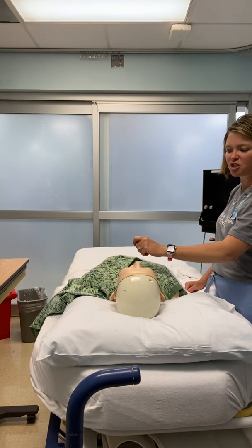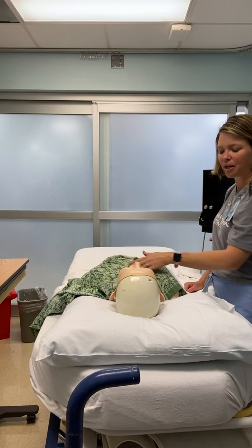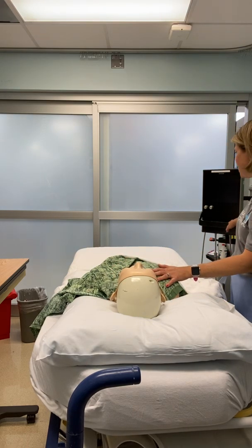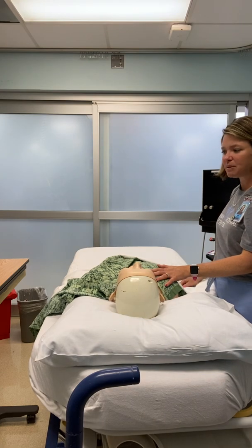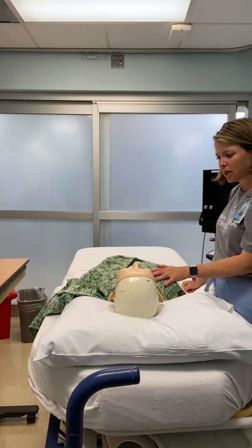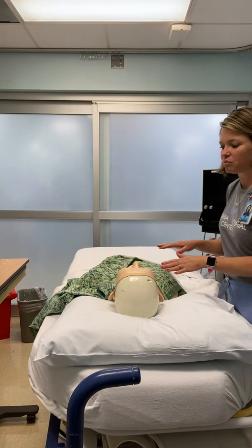So after the procedure, the patient is cleaned up, drape removed, those sorts of things. A lot of times there's just a little bit of blood at the site, so we can help make sure with gauze if we need to. We clean the machine with a CaviWipe, as I've mentioned, and you can keep that in either the PACU area or we'll ask for it to be taken back to holding.